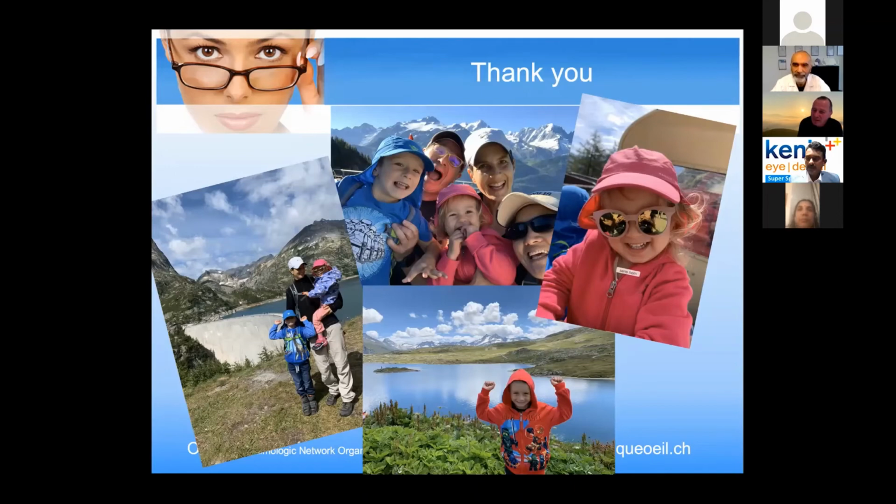Yes, Professor. It's written that below 2 millimeters, it decreases the function for near. But in real life, it's really not like this. We tell the patient to have good light, but it's really an easygoing lens. And I would say for the old people, they always have a small pupil, and they are not very unhappy during the night. They can still read something. It's astonishing, because this Lucidis was not at all what we expected.